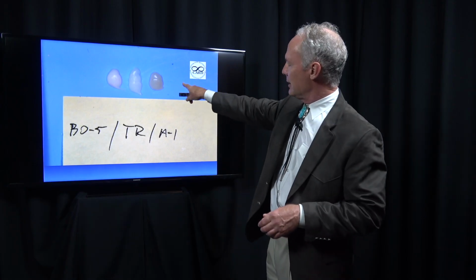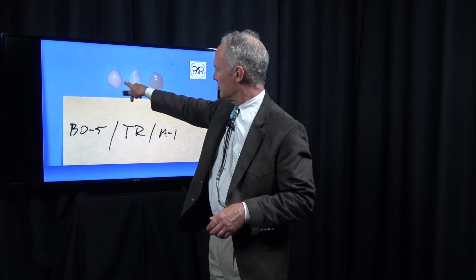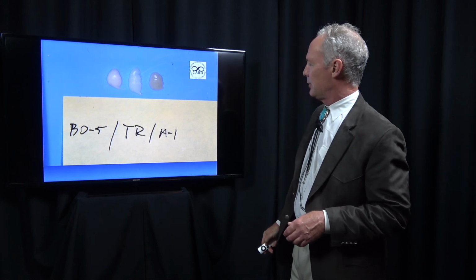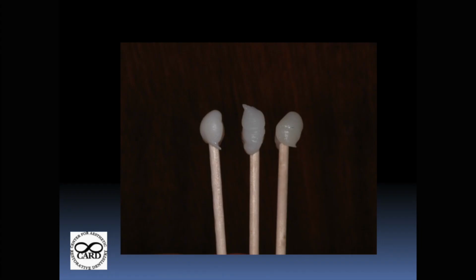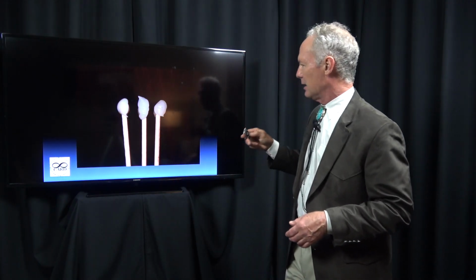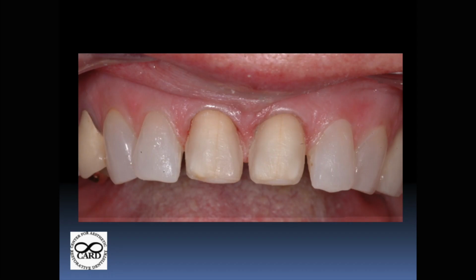So I've narrowed it down to these three by eyeballing it, and now I know this one's too dark, so it's between the B0.5 and the transparent or translucent. And I'm going to put these on cotton tip applicator sticks with transparent or neutral wax. You don't want a colored wax because that can influence your eye when you're determining the shade. Then I'm going to hold those tabs up next to the prep teeth.